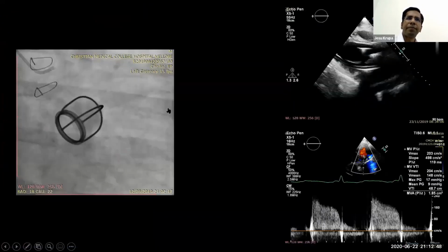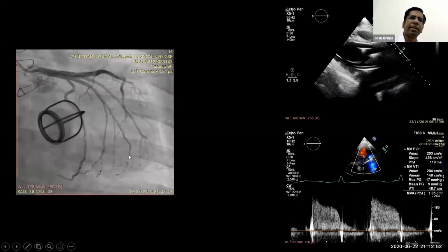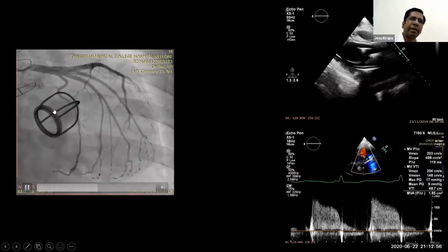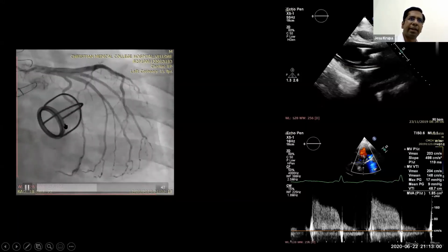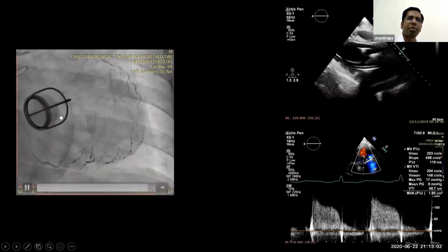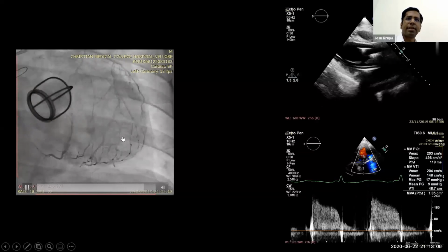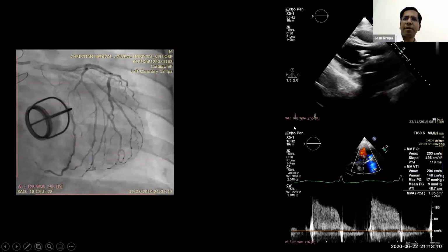This patient underwent an angio, and this is the fluoroscopy during the same time when the angio was being done. You can see the nice poppet motion inside the cage. So this is essentially a normal valve. So what was the problem?